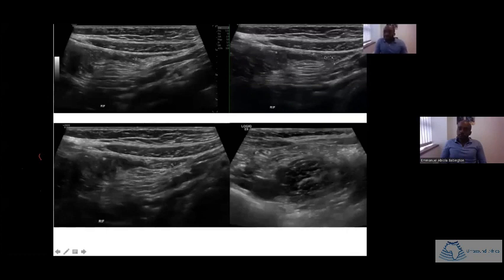If we can answer the question with ultrasound, then there's no point exposing our patients to radiation. So here again, we can see the normal appendix there, and over here just here. And you can see the iliopsoas muscle there. You can see the iliac vessels here. The appendix is medial, so it's there. In this case it appears more anterior, but it's more medial.